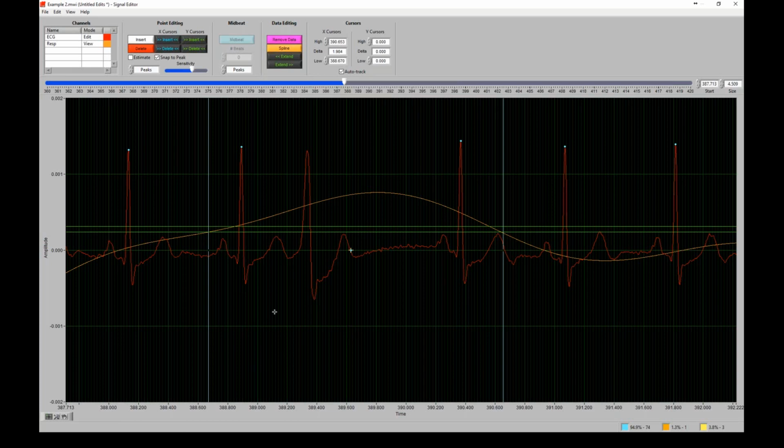So just to reiterate, when we get to this point, we're looking at extreme changes in beat-to-beat timing, which we certainly saw here and which led to this point being flagged by the MAD-MED algorithm. And we're looking for abnormal characteristics of the waveform. So the absence of a P wave is going to be an indicator.